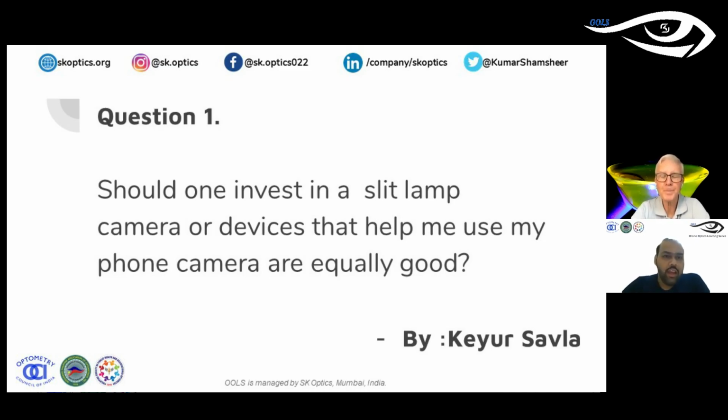Yeah. And the point you mentioned really struck me, because if you use a phone, nowadays you have a smart TV in your practice. From the phone, you can connect it to a big TV where not only the patient can view it, but if there are any attendees, you can explain it on a bigger screen. Absolutely, that would be more apt in this situation, I guess.